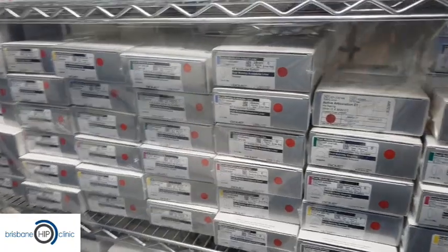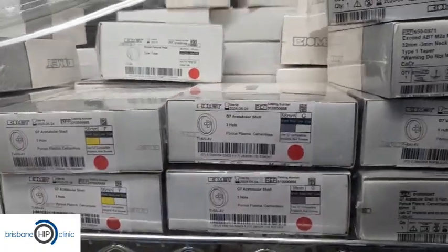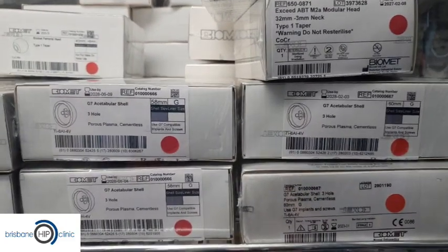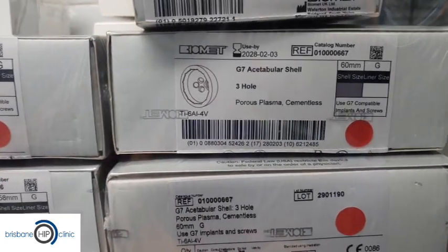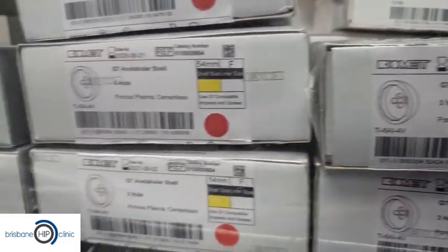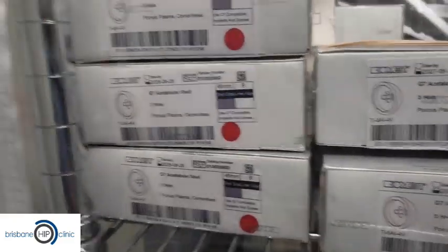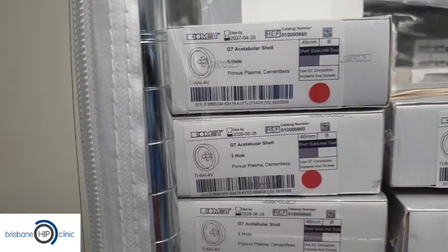Here are some of the options we have. Up the top, these are all different cups — all different sizes. You can see that's quite a big cup, that's a 60mm cup, here's a 58mm cup, down here there's a 56mm, and it goes all the way down in sizings to quite small sizes — even smaller than these ones.